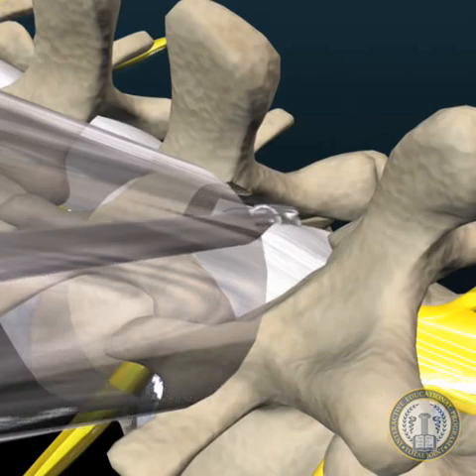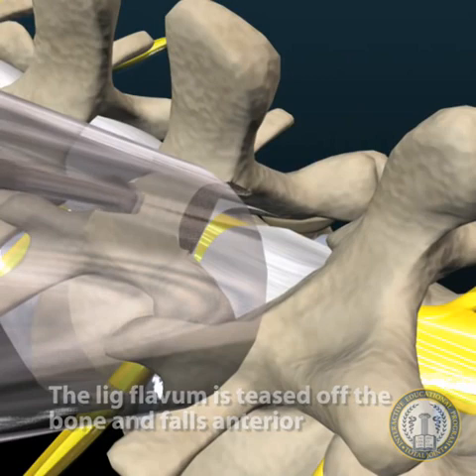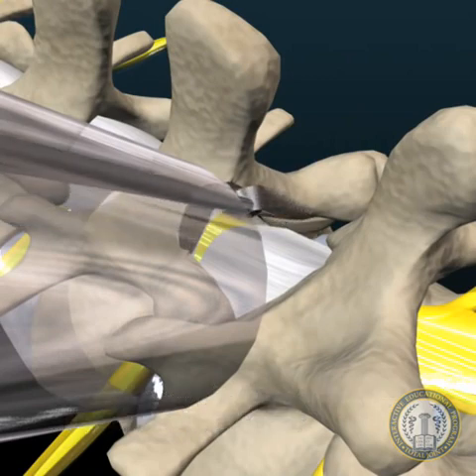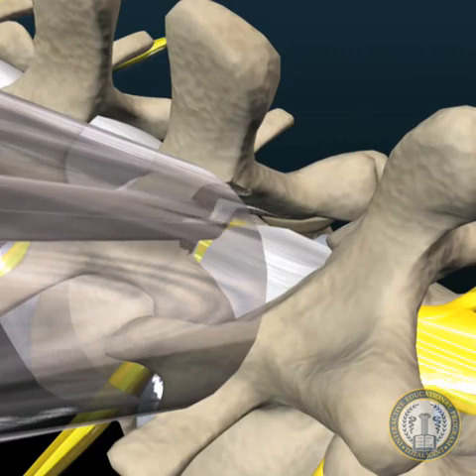The ligamentum flavum is dissected off the inner surface of the contralateral lamina and facet with curettes and blunt dissectors, and these contralateral bony structures are drilled from within the spinal canal, using the ligament and suction as guards between the drill and dura.